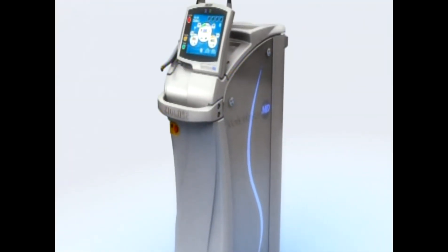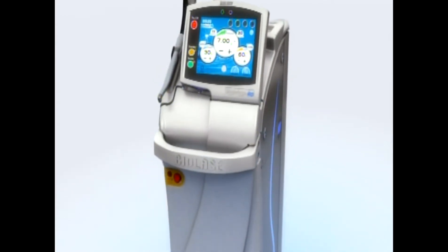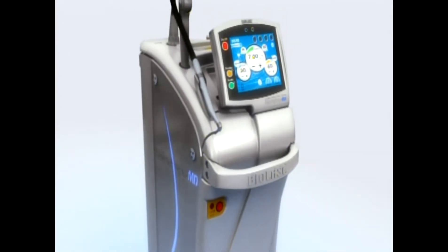The Waterlase MD is capable of cutting any class cavity preparation — one, two, three, four, or five — without any limitations.